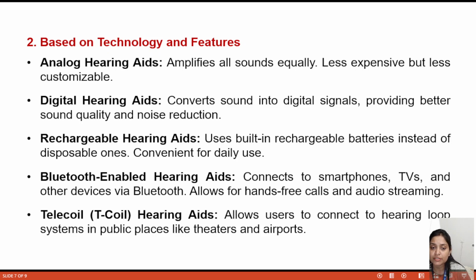It is very convenient for daily use. Then Bluetooth-enabled hearing aids can easily connect with a smartphone, TV and other devices via Bluetooth, allowing hands-free calls and audio streaming. Telecoil hearing aids connect to the hearing loop system in public places like theaters, airports, and some churches.